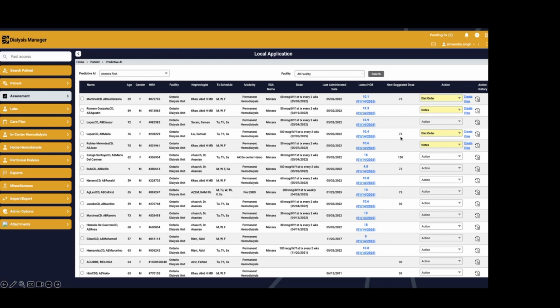So the reason I wanted to show these 2 examples is because there's much more to the story than the most recent hemoglobin. If we just react always to the most recent hemoglobin, we'll not capture the entire picture. And what we've shown with this Mircera model that'll be available very soon is that we can keep people in the target range, the KDIGO target range, better.